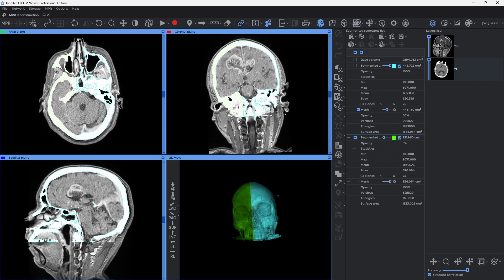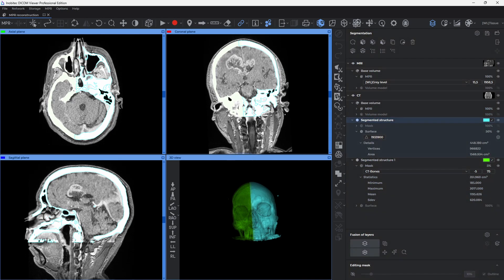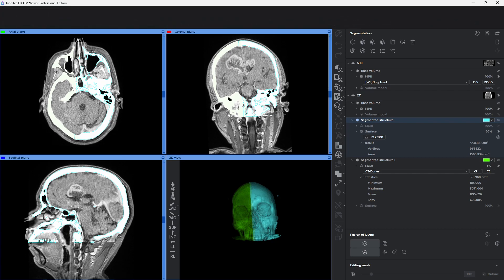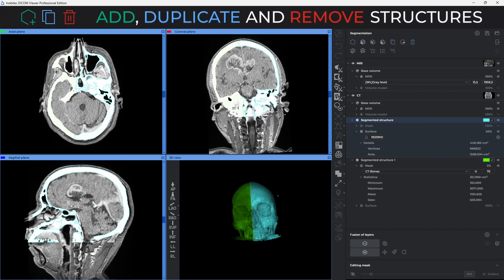Using the new segmentation panel, you will be able to perform complex segmentation tasks faster and more conveniently. There is now a more compact way to add a new structure, copy an existing structure, or remove a structure or surface.